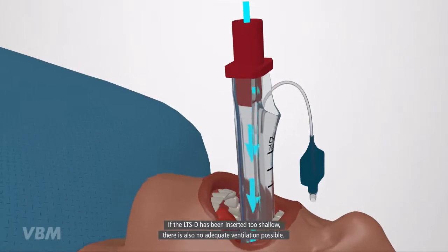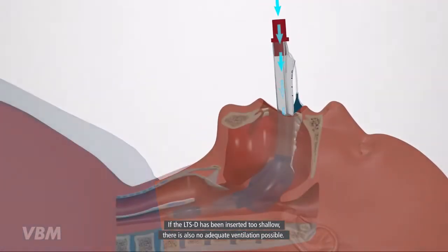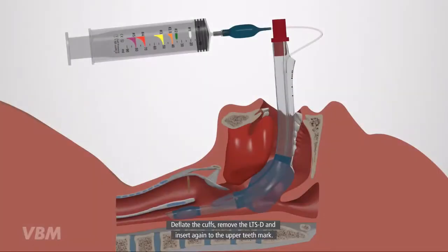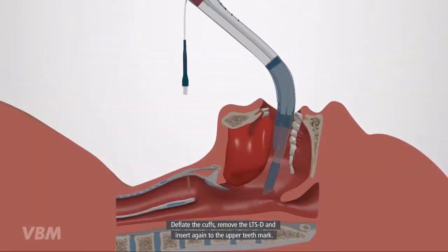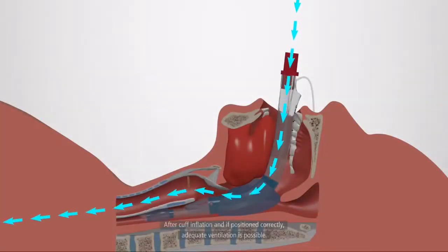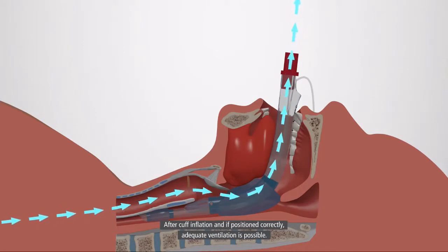If the LTSD has been inserted too shallow, there is also no adequate ventilation possible. A new insertion is necessary. Deflate the cuffs, remove the LTSD, and insert again to the upper teeth mark. After cuff inflation and if positioned correctly, adequate ventilation is possible.